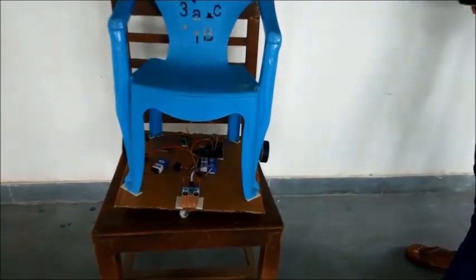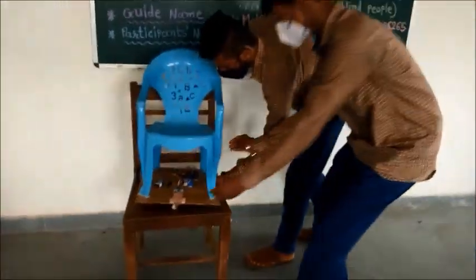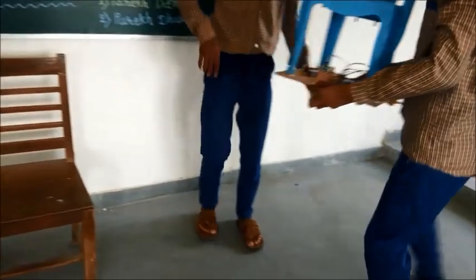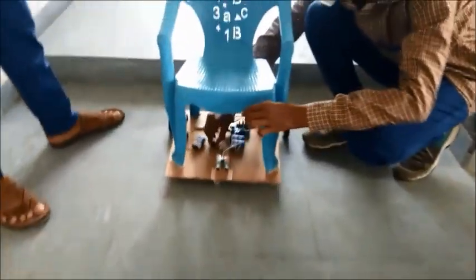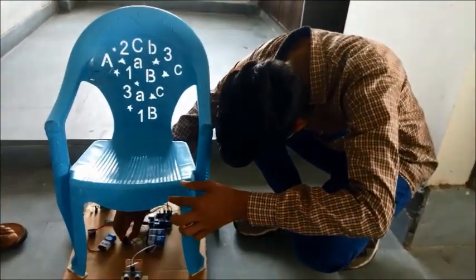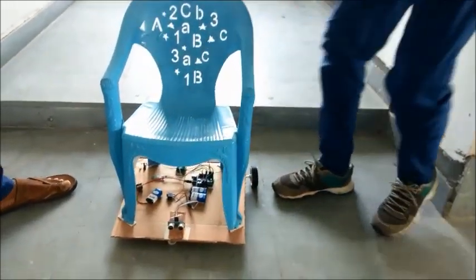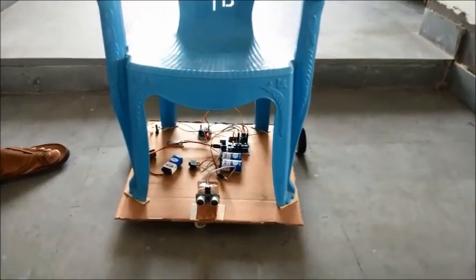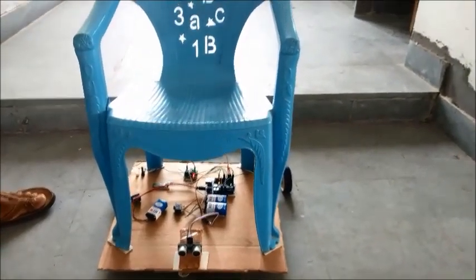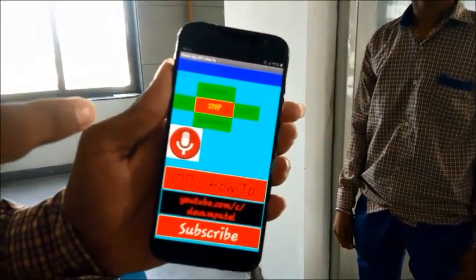Now we will see the actual working of this project. As mentioned, we have to connect the wheelchair to the phone. So now I will connect it to this phone. You can see the wheelchair is connected now.